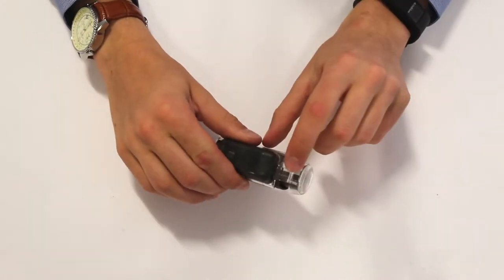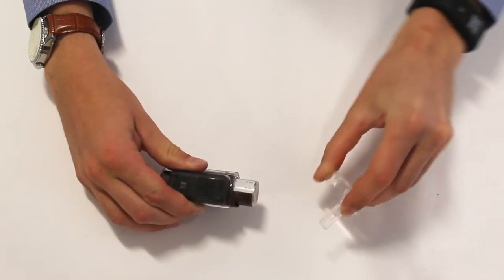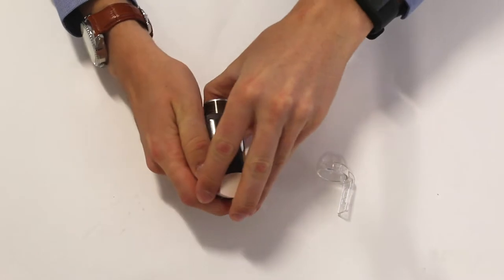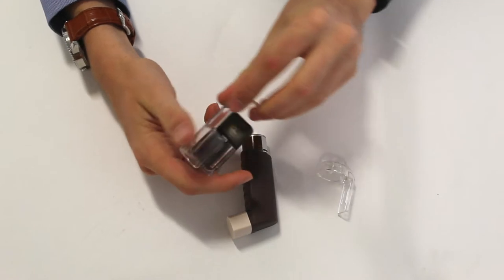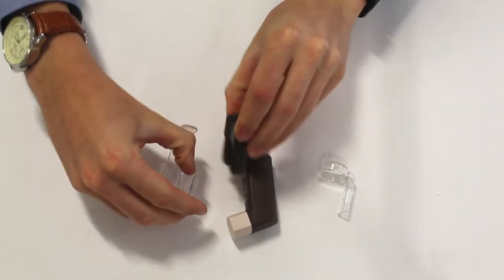To dismantle your puff clicker, where the cap goes into the module, there is a little clip that you can press and that will release the cap. You can slide out the inhaler canister, and again a little clip in order to release the module from the clip.